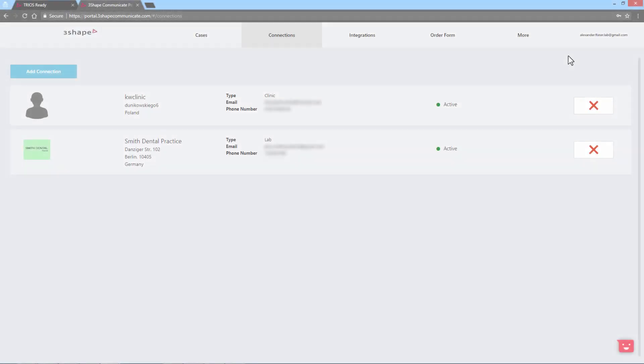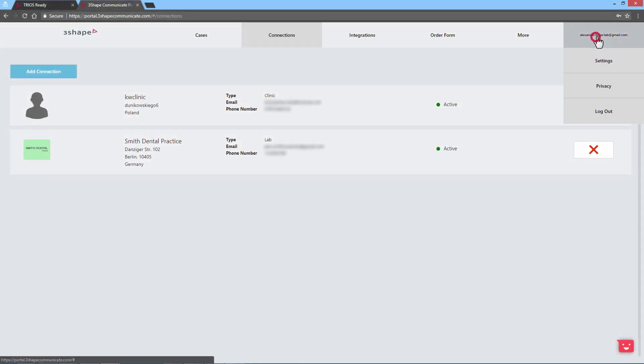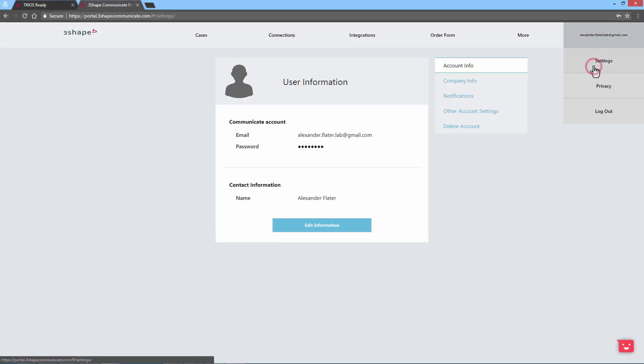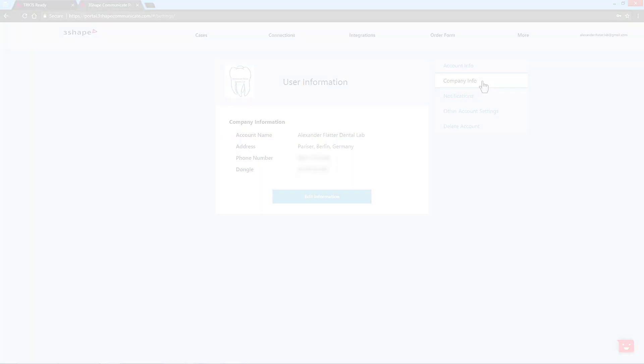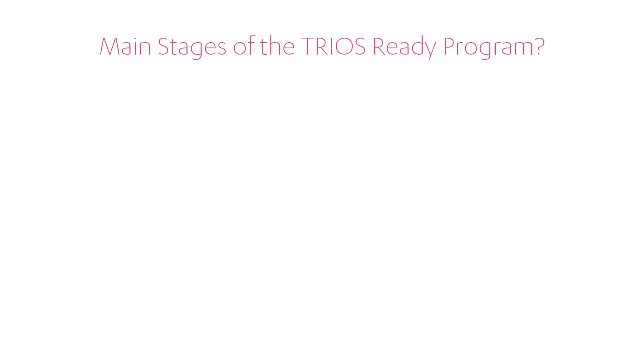Once you acquire TRIOS Inbox standalone, make sure you've created a 3Shape Communicate account with valid information about your lab, or adjust the data on an existing account on the Communicate portal. Now you can become TRIOS Ready in three easy steps.